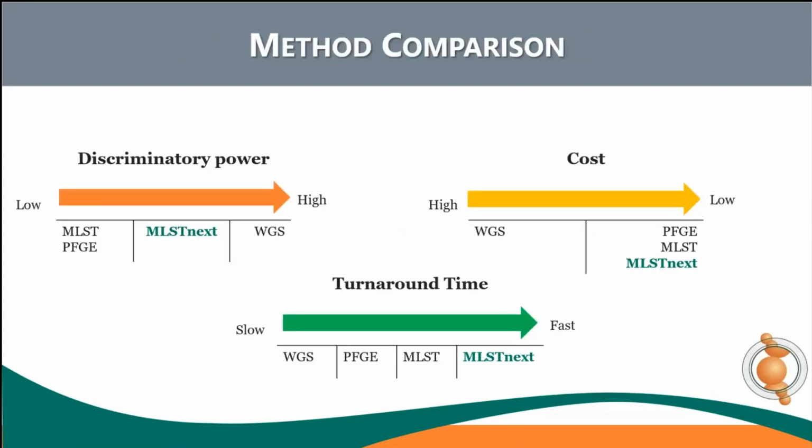Today, we introduce four major methods used for genotyping and pathogen tracking in the food industry. All four methods have their strengths and limitations in terms of discriminatory power, cost, and turnaround time. These four methods can help food processors understand the pathogens occurring in their facility.